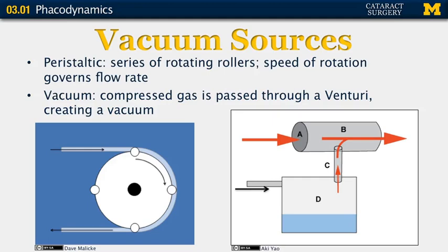And these have different ways of functioning at the time of cataract surgery, so we'll talk about those shortly. So now we have a question.